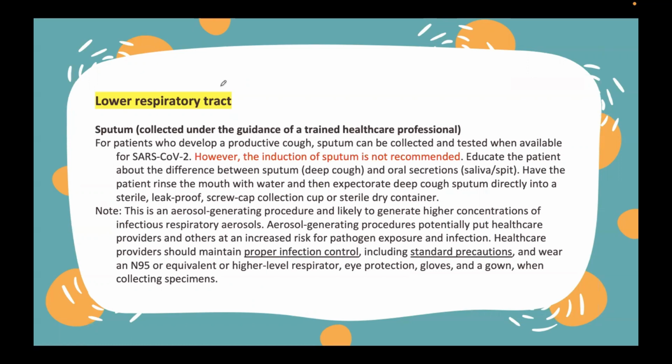Pwede daw po si sputum. Okay, lalo na kapag ka medyo productive naman yung cough ni patient, pero wag na wag daw pong gagamit ng sputum coming from induction or yung mga sputum na galing sa mga patient na nag-undergo ng nebulizer. Okay, educate the patient about the difference between sputum kasi alam niyo po ang mga sputum medyo mahirap pong i-collect yan. Kasi ang sputum galing yan sa ating deep cough or expectorated galing sa lungs.